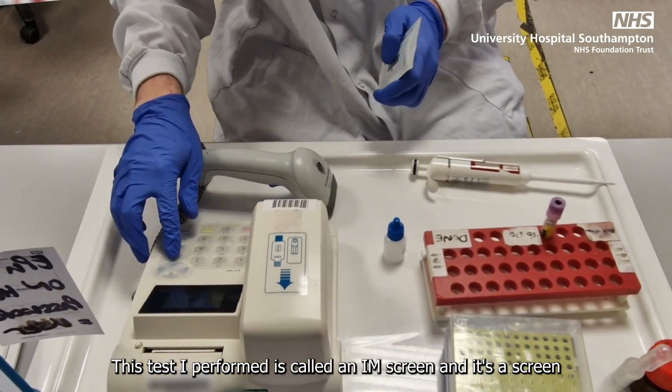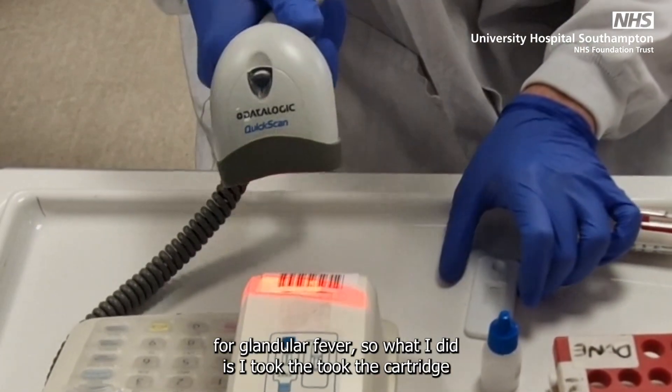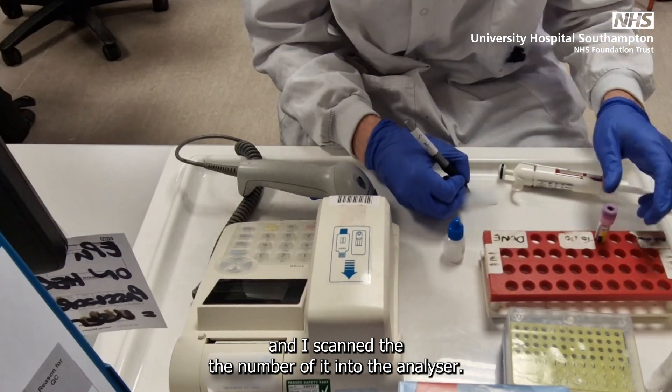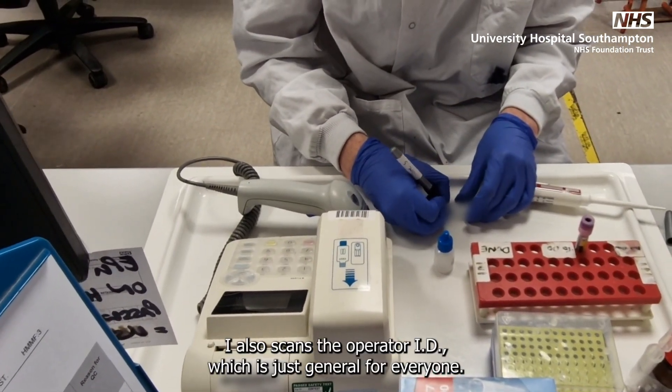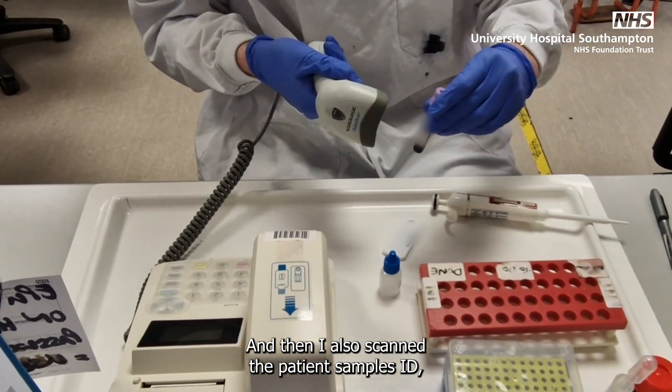This test I performed is called an IM screen, and it's a screen for glandular fever. I took the cartridge and scanned the number of it into the analyzer. I also scanned the operator ID, which is just general for everyone, and then I scanned the patient sample's ID.